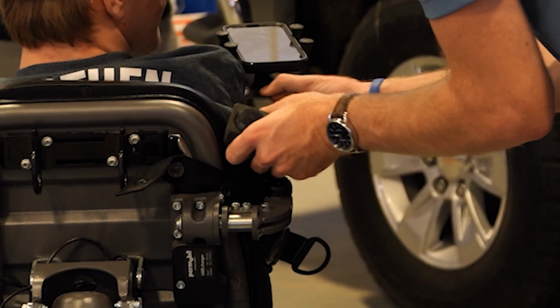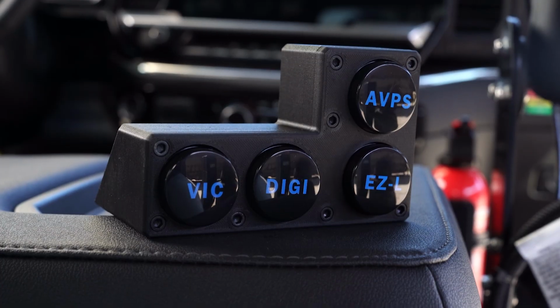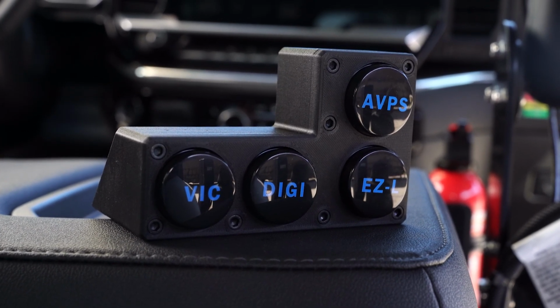We also have a few options for button mounts. We have the Gen X button mounts that can go onto the side or the top of your Gen X display. And we have single button mounts that can go on the display, on an input device, or anywhere in the vehicle that has a smooth surface. We are also able to create custom accessories for activation points. In the past, we created an L-shaped magnet box that was able to mount directly onto the user's wheelchair. It controlled his AVPS system, voice command, digitone, and easy lock.